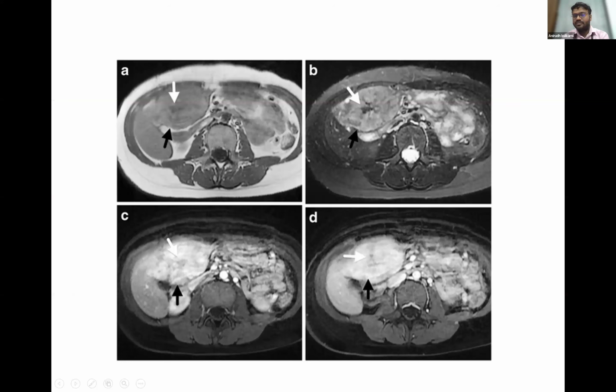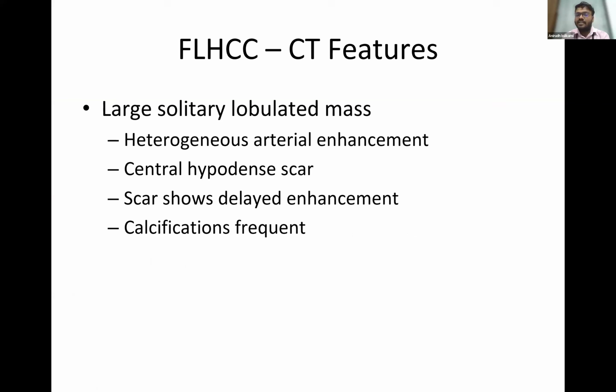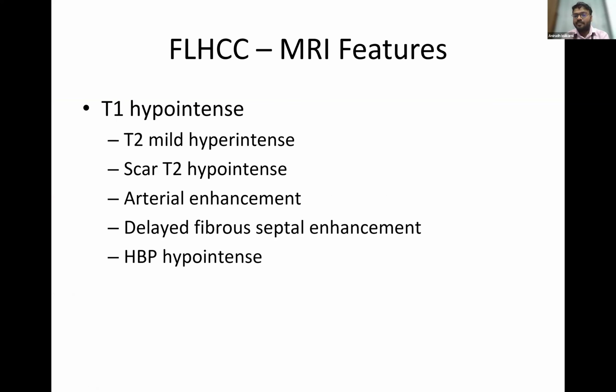This is very important. Why will the scar show delayed enhancement? Because it has a fibrous component. So because of fibrous tissue, it will show delayed septal enhancement.